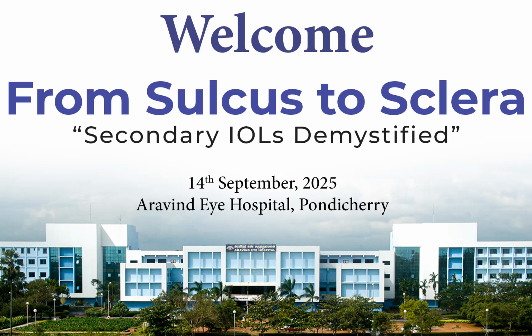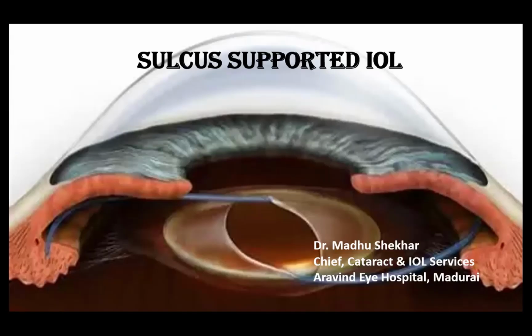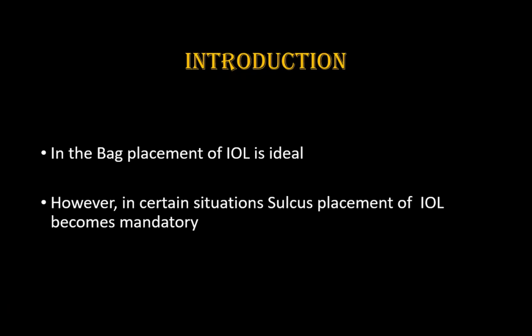Today I will talk about the sulcus fixated IOL, what the indications are and when to place it. As you all know, in-the-bag placement of the IOL is ideal. However, in certain situations, a sulcus fixated IOL is mandatory or required.